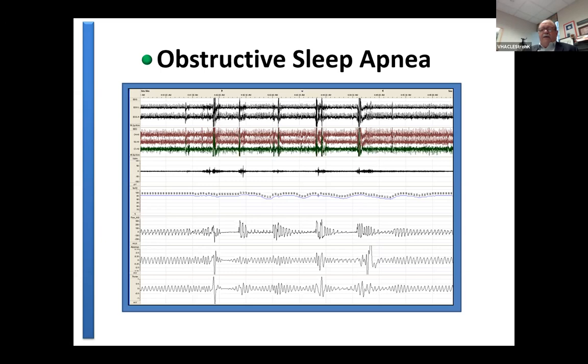So maybe this is what Denise is saying: maybe if their muscle tone was just a little bit better. And then at the other end of this, the last apnea, the last event, you see the damping down of the system. He goes into a low loop gain because there's 1, 2, 3, 4, 5, 6, 7 breaths, almost a big abdominal or rib cage motion. And then it goes up a little bit, comes back down, and settles in again pretty nicely. So he dampens his loop gain at the end. So it's all there.